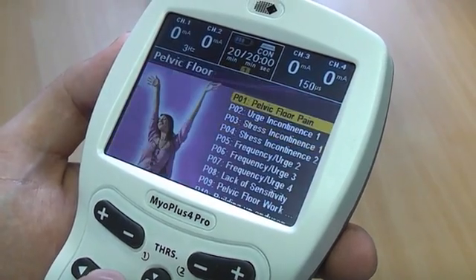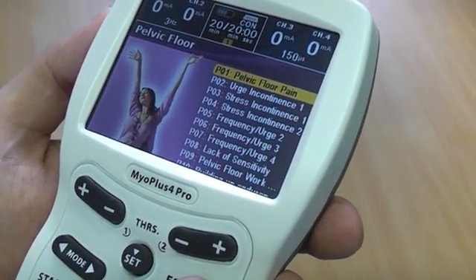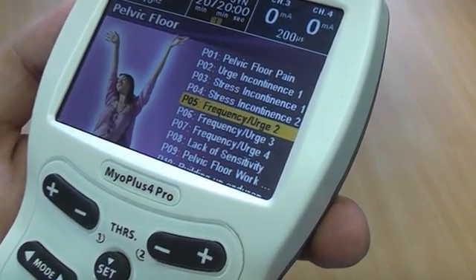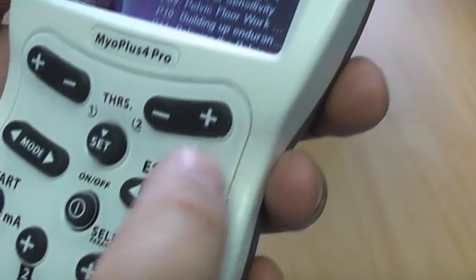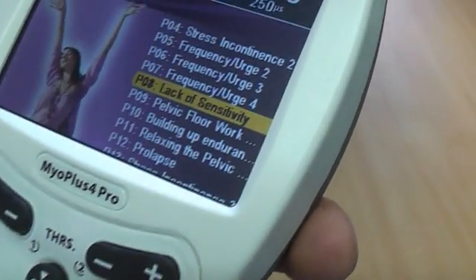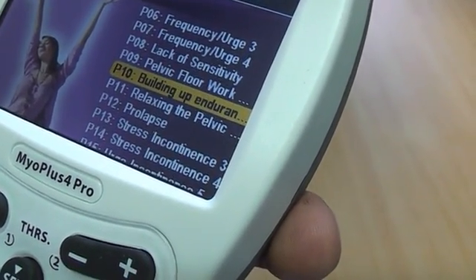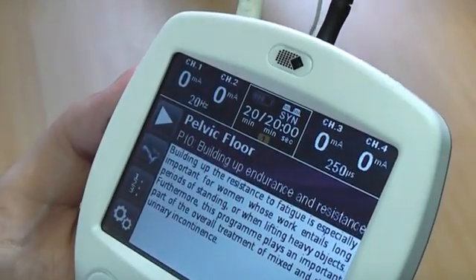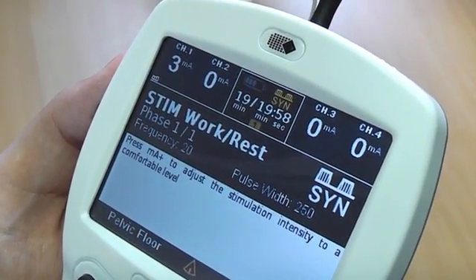Keep pressing the mode button until you reach the incontinence mode. Now press the program button to select one of the preset programs, for example stress incontinence, frequency and urge incontinence, or lack of sensitivity. After you have selected your preferred program, you can then start the program by pressing the MA plus button until you get a comfortable contraction.